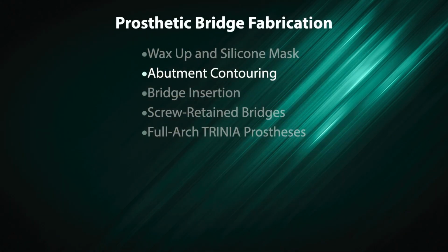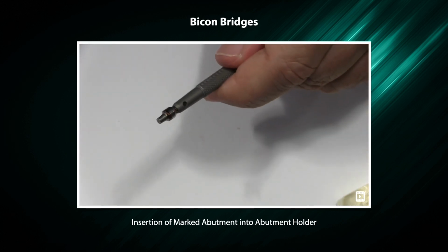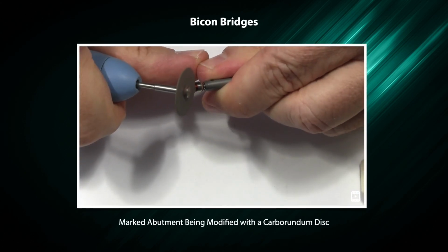Abutment contouring. Insertion of marked abutment into abutment holder. Marked abutment being modified with a carborundum disc.